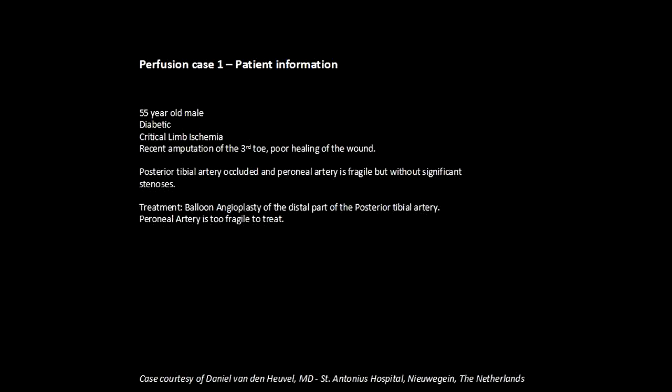Now, some of you might be a little bit puzzled by this, but I'll show you a patient who underwent a procedure and whose images were analyzed with this tool. We're talking about a 55-year-old male who is a diabetic and who's suffering from critical limb ischemia, and he had a recent amputation of his third toe. However, the wound was not healing well, and he came back to the angio suite and got his posterior tibial artery revascularized by balloon angioplasty.